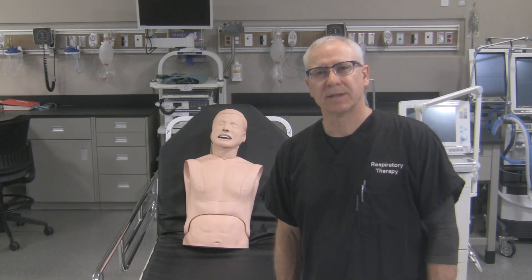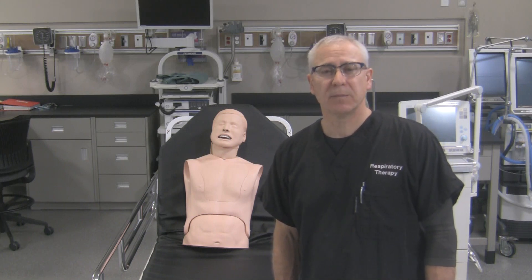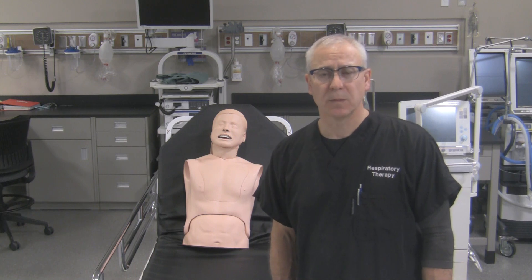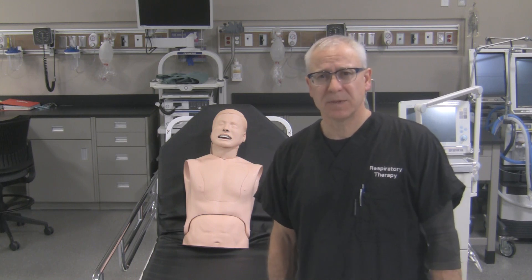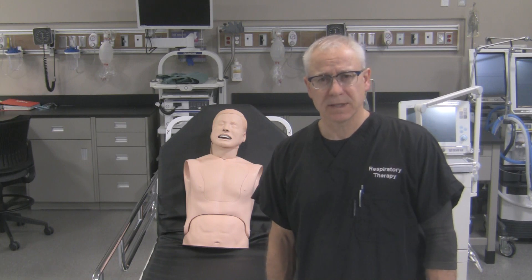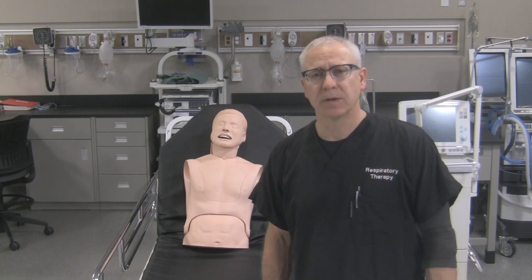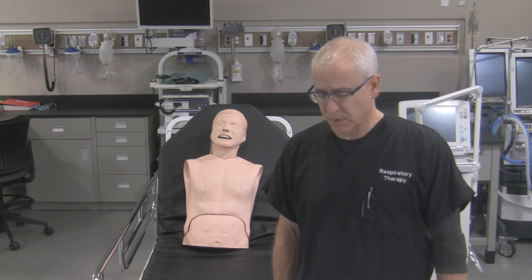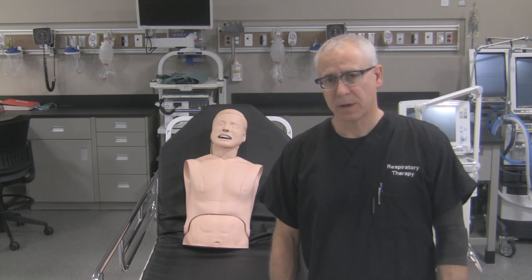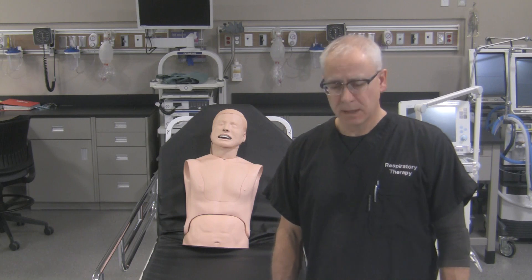Hi, this is George. What I'd like to do today is show you how to quickly place a laryngoscope blade on a laryngoscope handle. It is fairly simple to do, but sometimes you might get your fingers caught in the wrong places, which could lead to a pinch or a scrape during attachment or detachment. This will show you how to put it on safely and how to detach the blade safely as well.